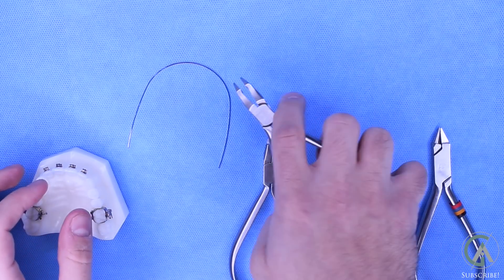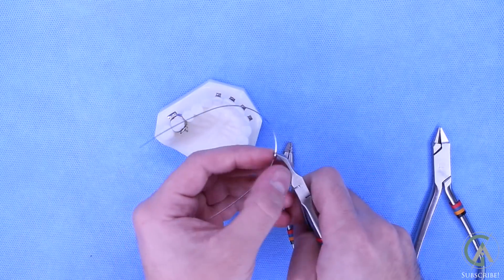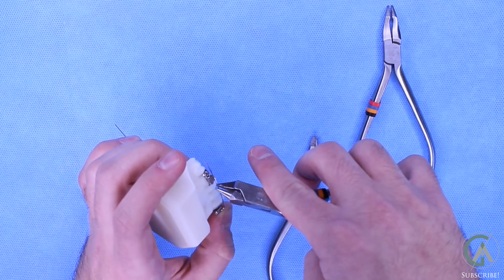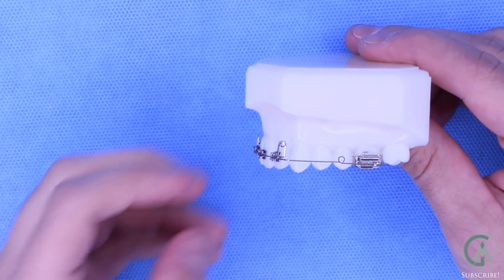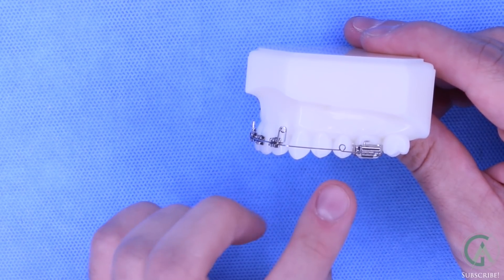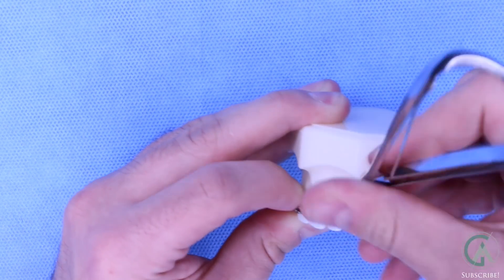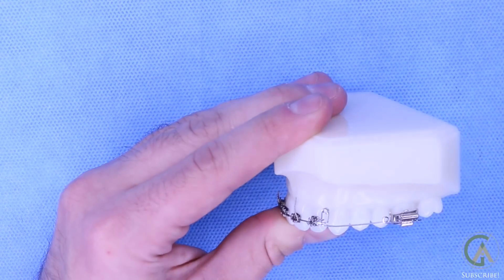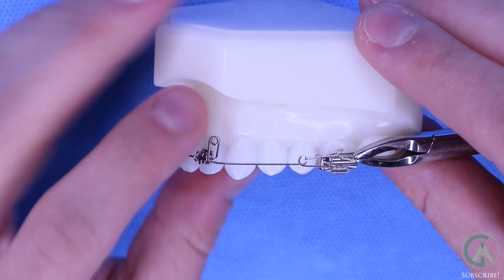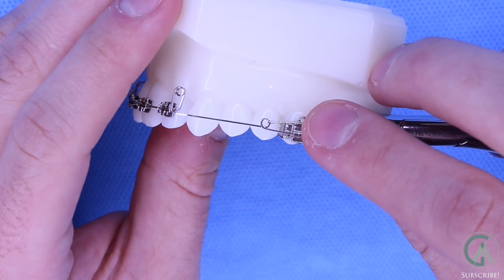I'm going to show you guys how I bend the closing loop. We're going to create a closing loop just behind these front teeth — imagine there was a gap behind them and we were trying to bring them backwards. Looking at it more closely, this is what the closing loop will look like. This is the coil, and this little loop is used to tie it back. I'll show you how we activate the closing loops in a second, but first we have to make sure we tie this wire in so that it doesn't move. Everything is now tied in.